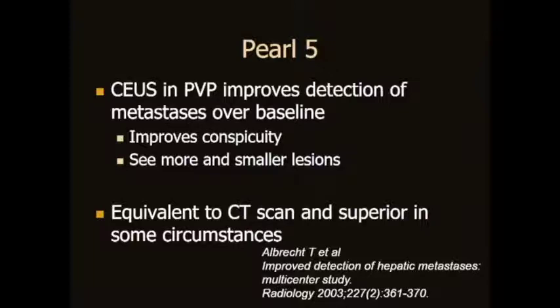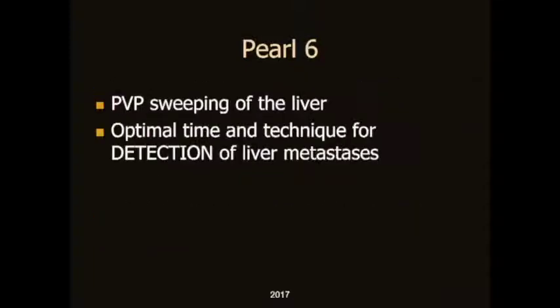Now, in a study that Peter Burns and I participated in with the Europeans way back around 2000, this is the publication which I cite. In this publication, we had several hundred patients, and we had results that were equivalent to CT scan and superior in some circumstances in looking at metastases in patients with CEUS.